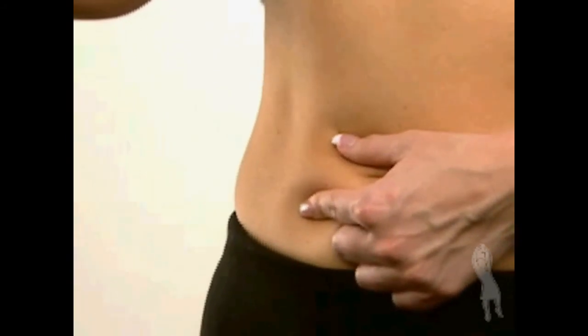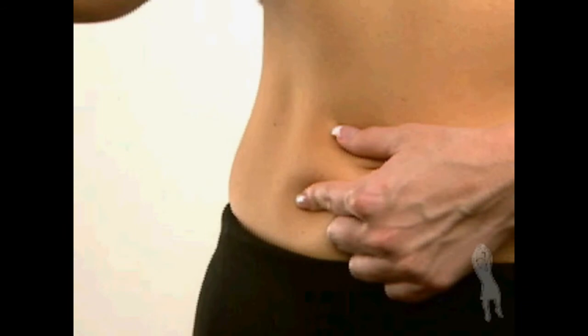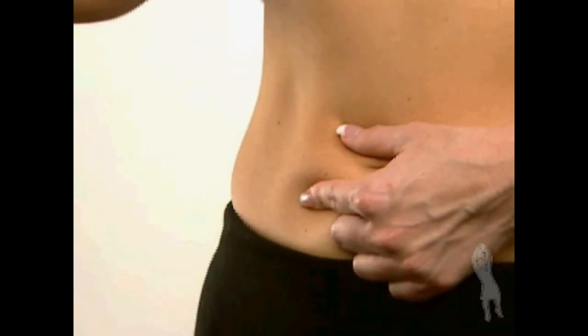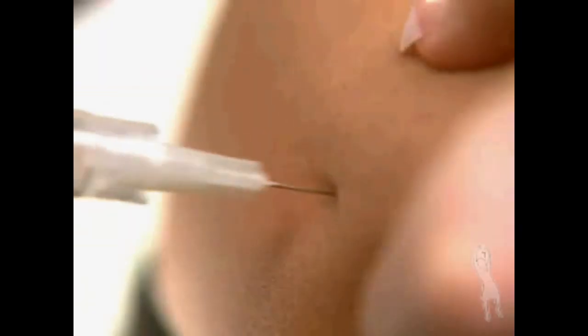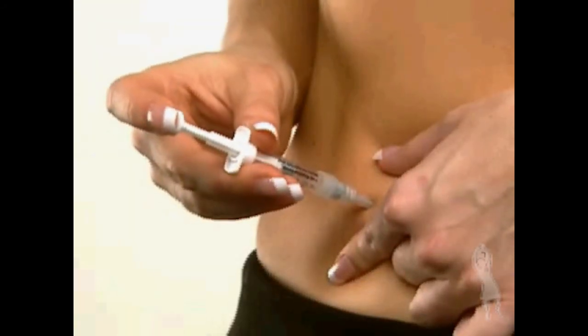Hold the syringe with one hand the way you would hold a pencil, and pinch the skin on the chosen injection site with the other hand. Insert the entire length of the needle into the skin at an upward angle of about 45 to 90 degrees, as indicated by your doctor or nurse.